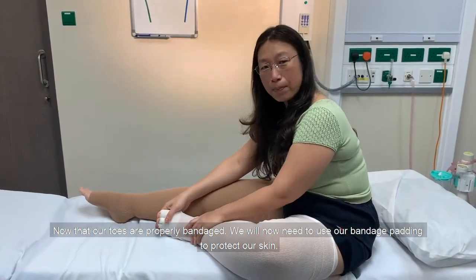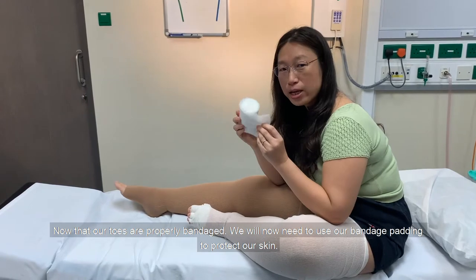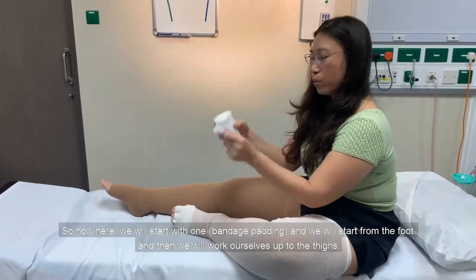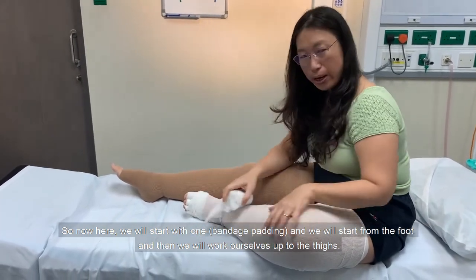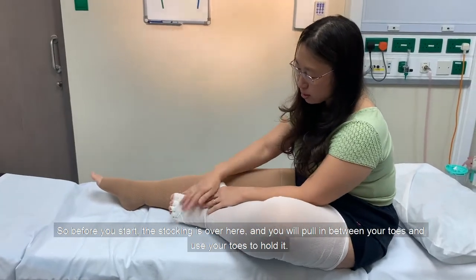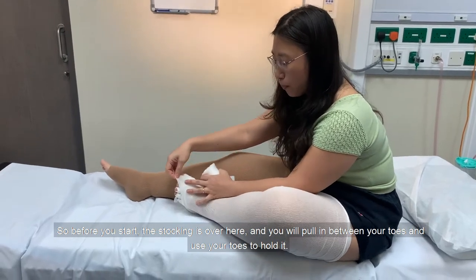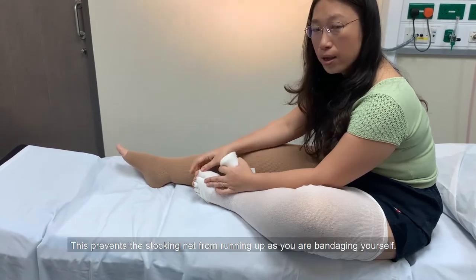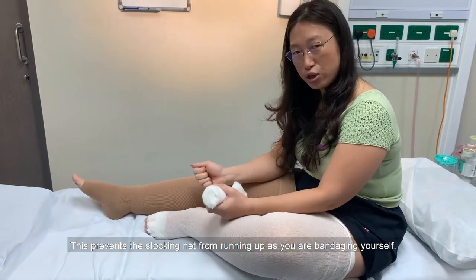Now that our toes are properly bandaged, we'll need to use our bandage padding to protect our skin. We'll start from the foot and work ourselves up to the thighs. The stocking end is here — you will pull it in between your toes and use your toes to hold it. This prevents the stocking from riding up as you're bandaging yourself.